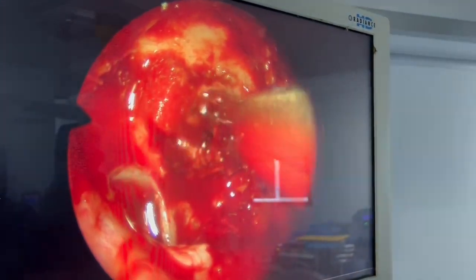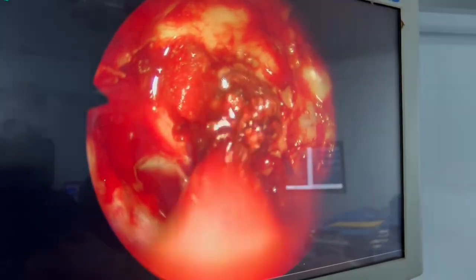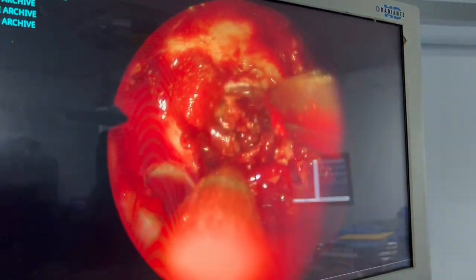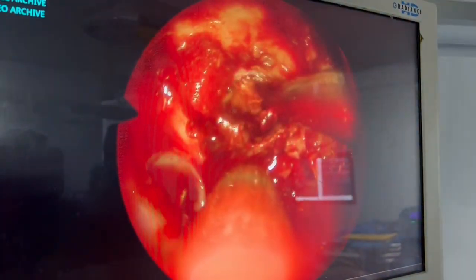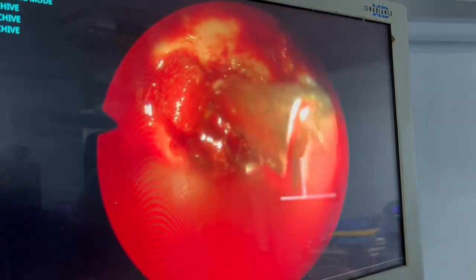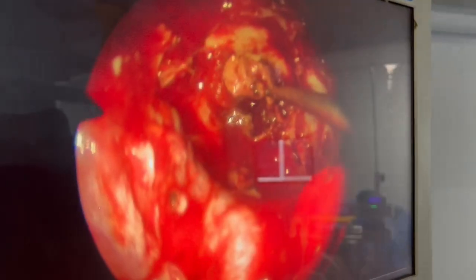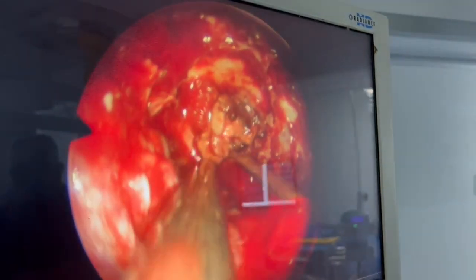So, key surgical principles. Central debulking first, periphery last. Never start lateral dissection early because of carotid and cavernous sinus danger. Avoid aggressive superior dissection to avoid damage to the optic nerve. Leave adherent remnant if close to vital structures like the carotid and optic nerve. Always reconstruct the sellar floor properly to avoid CSF leak. The last phase of this endoscopic resection is hemostasis and reconstruction.